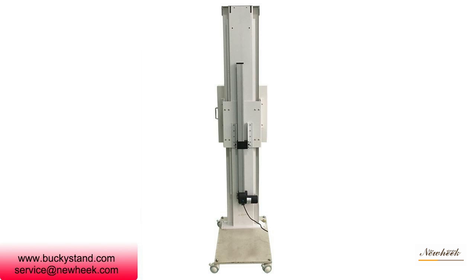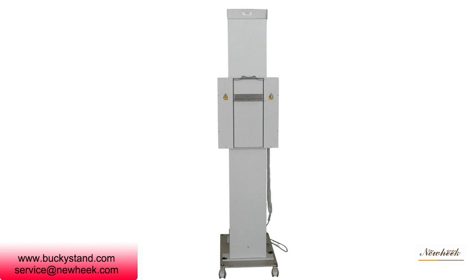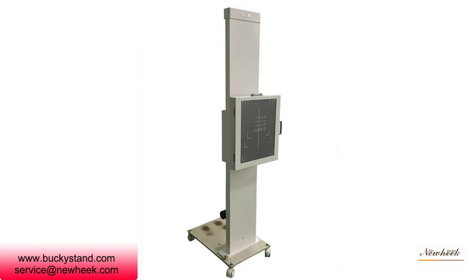Bucky stand takes radiology of the head, chest, abdomen, joints and other parts of the body by cooperating with various X-ray machines. Newheek bucky stand is mainly composed of 4 parts: column, slide frame, film box and balancing device. Filter grid is our optional component.